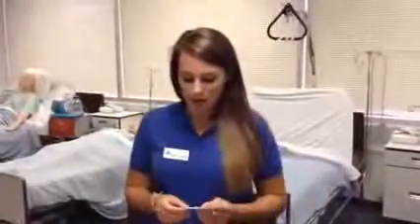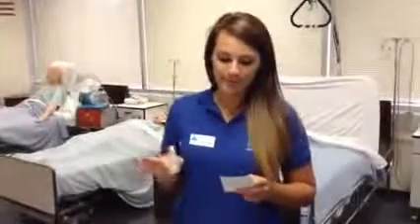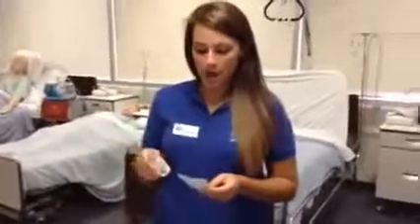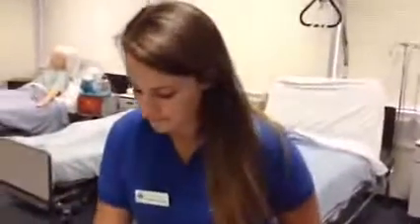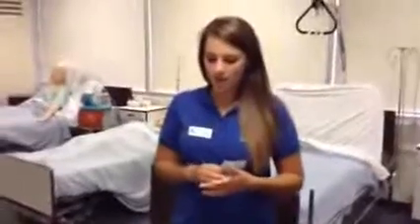We will be administering 1,000 milligrams, and we have 500 milligrams per milliliter. Therefore, that would give us 2 milliliters. Also, with the drop factor of 10, administering over 30 minutes, it will be 17 drops per minute.